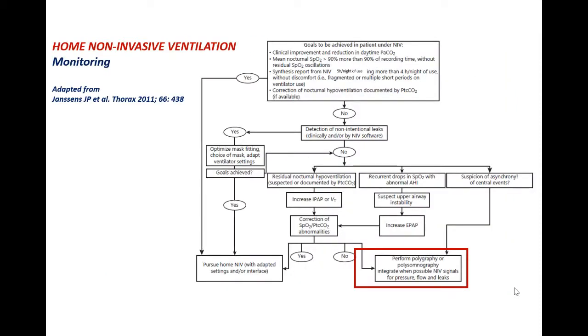Respiratory polygraphy, as you can see, was published in Thorax by the SomnoNIV group, which I belong to. Respiratory polygraphy is the last exam to be performed for monitoring non-invasive ventilation.